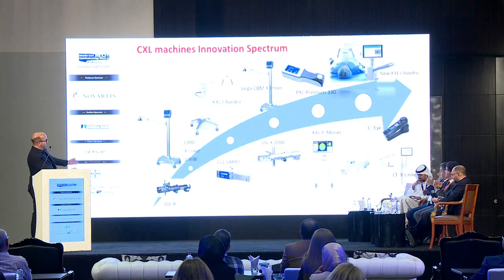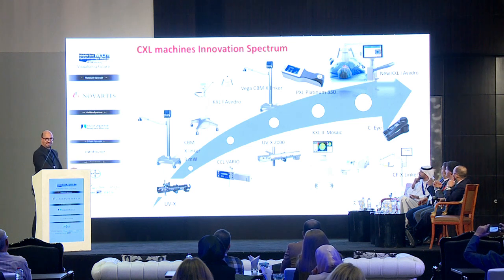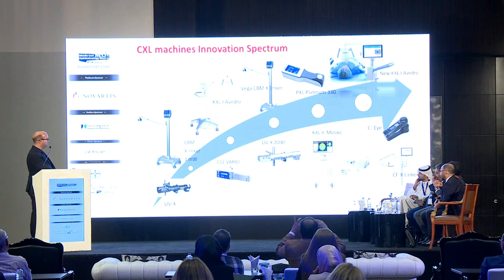Of course, all the machines adapted to this world of change. And we have a lot of machines in the market to do accelerated, pulsed light, high fluence protocols.